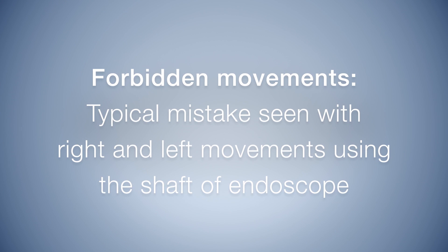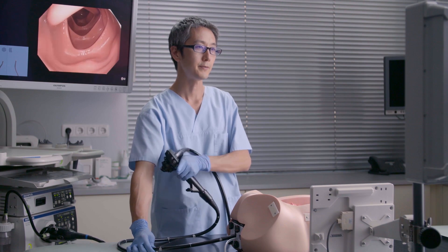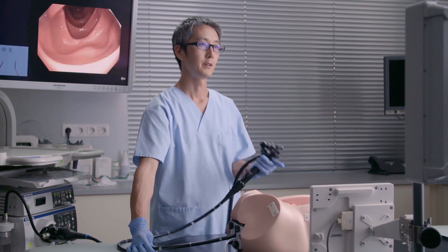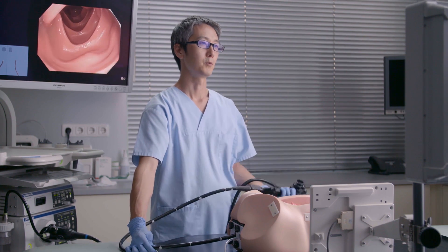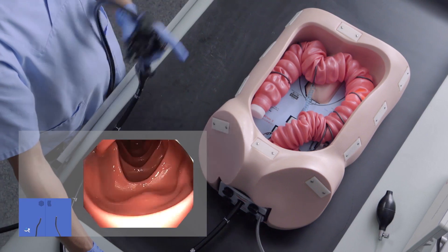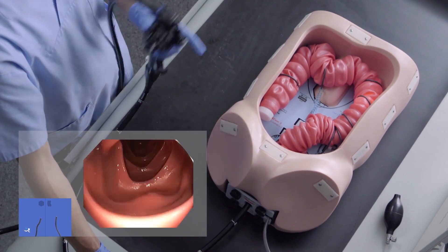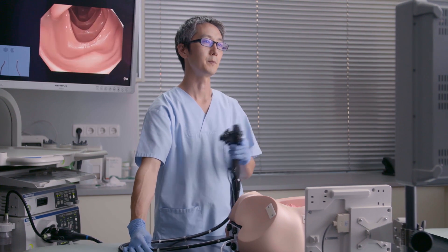A typical mistake seen is right and left movements using the shaft of the endoscope. This right and left shaft movement that people think works does not do anything inside the colon, so this is a movement that should be forbidden.